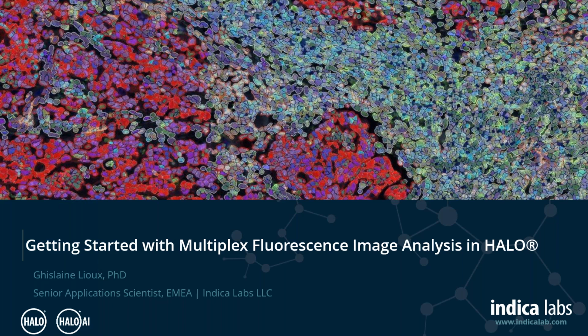Thanks a lot, Ben, for your kind introduction, and welcome everyone to this webinar about getting started with multiplex fluorescence image analysis in HALO. So I meant to say, first off, that this webinar is not a masterclass, but rather an introduction to multiplexing workflows. So this is aimed at those who are new to these technologies or considering adopting them.